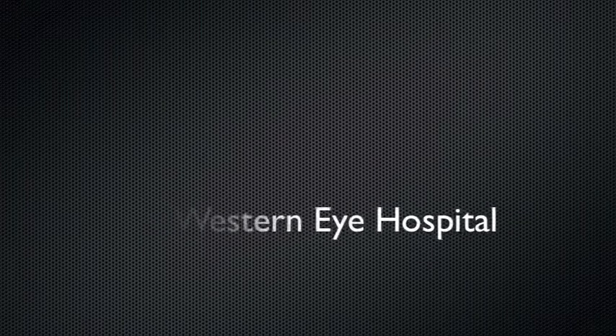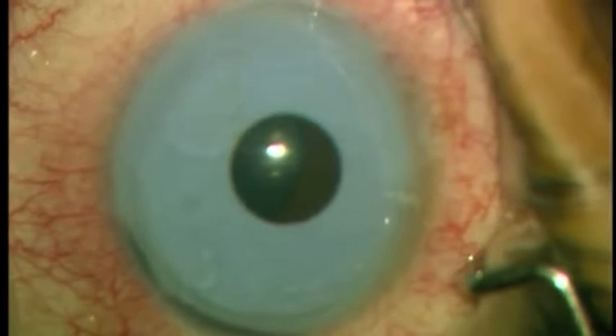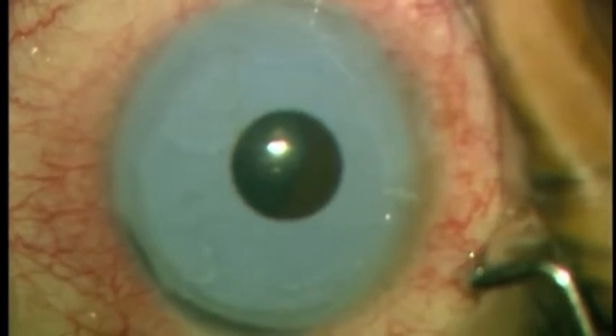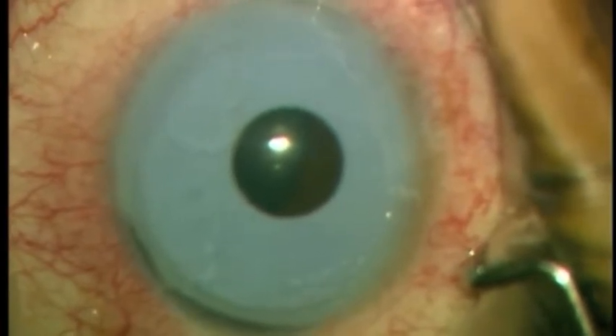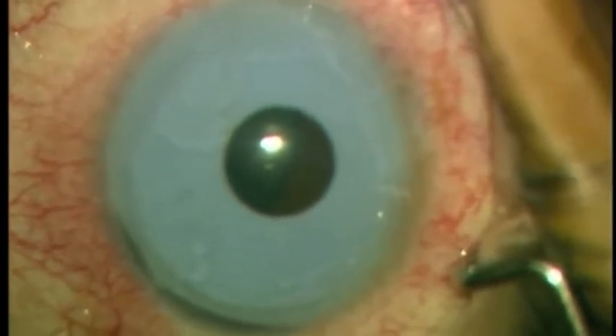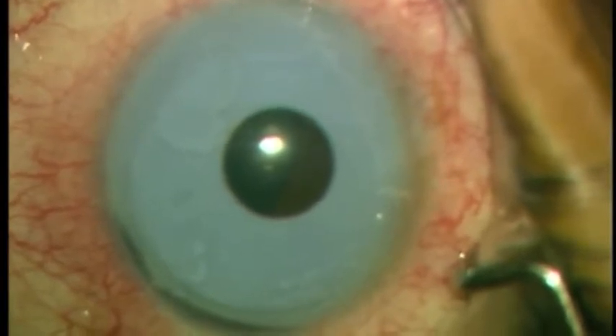Several years later he presented to us with pain, blurring of vision, raised pressure in his eye, inflammation and corneal edema, which necessitated surgical removal. This video highlights our surgical technique for removing these implants.